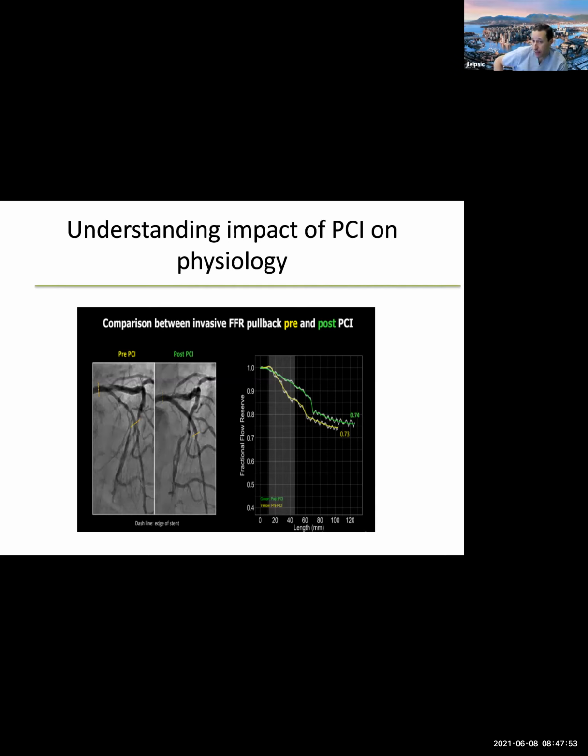So CAD-RADS is being iterated. So CAD-RADS 2 is under revision. And in CAD-RADS 2, there will be an element around plaque. Right now, as you know, in CAD-RADS, it just has a rider with V, vulnerable, which requires a single lesion with positive remodeling or low density plaque.